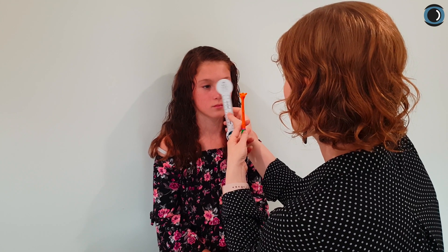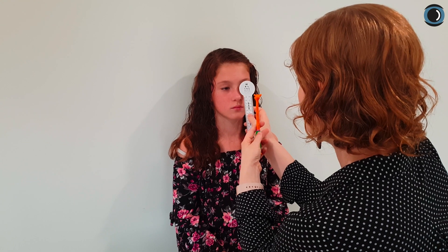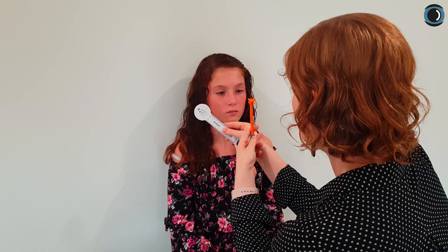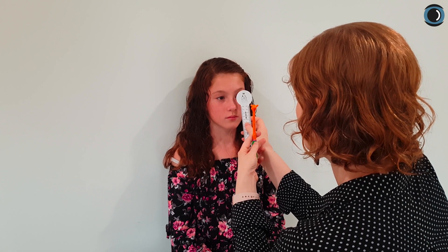Now if we want to look at her phoria, there are various ways to measure it — with specific tools or with the cover test, depending on the level of quantification you want. With the cover test, we use the alternating cover test to assess magnitude and direction. We can see a little bit of exo. The unilateral cover test lets us see how quickly an eye recovers to help distinguish between a phoria and a tropia. It's definitely not tropic — she's got two wonderful eyes that work very well together as a team.